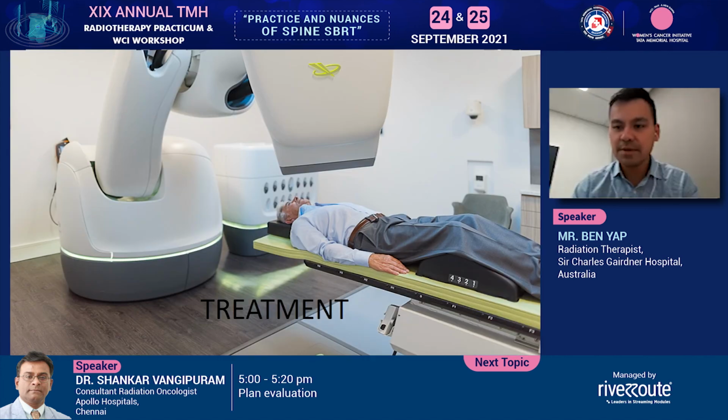Briefly about treatment, if that's all right. I know we're coming up short on time. So for our spine treatment, we choose an appropriate imaging technique, which means something that obviously you can see on the image. My tip for you is keep the default KV and MA, and then increase incrementally until you have a clear image. Usually, if you need to increase, it's for larger patients, but in most cases, you don't tend to have to do any of this.